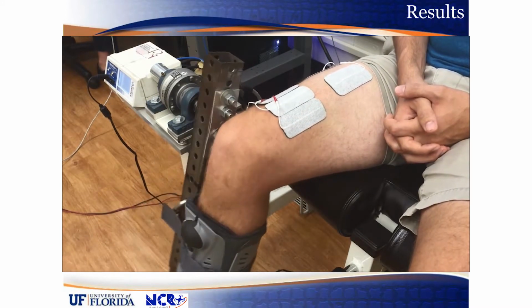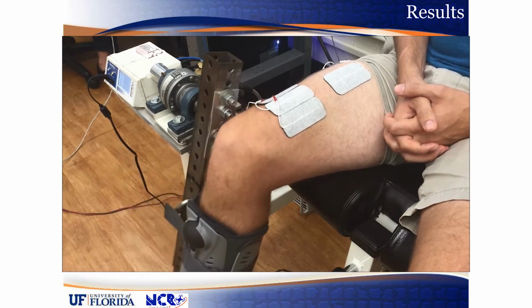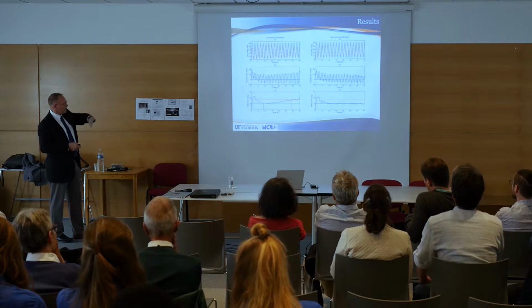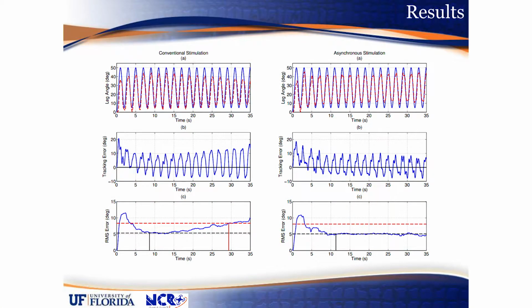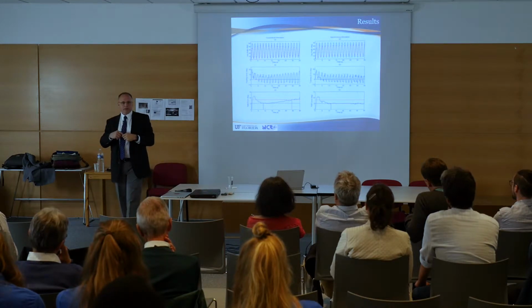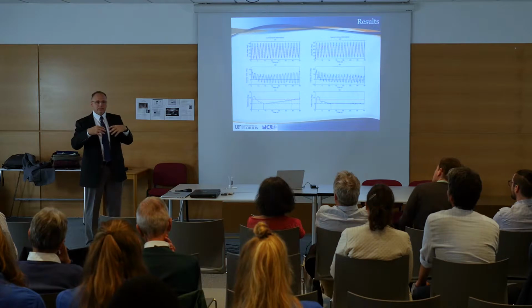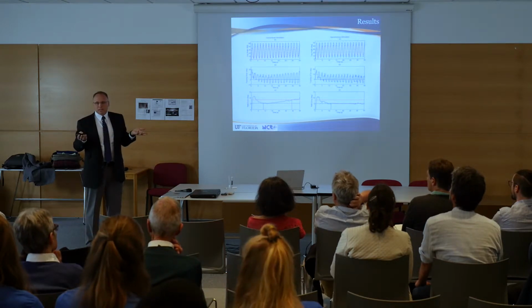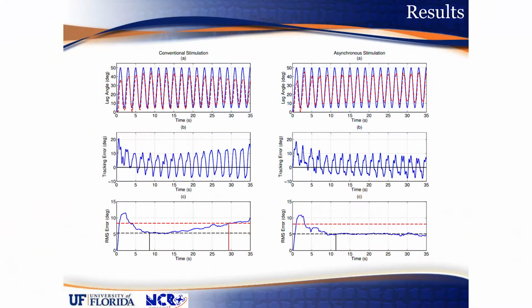You can see the multiple channels across the quadricep there. And even though each channel is at a lower frequency, you still see that overall it's a nice smooth contraction. And the results from that test are that on the left is conventional stimulation, and in this middle plot you see the tracking error is increasing, and that's due to the fatigue, meaning that the controller wants to penalize the error and will stimulate the muscle with greater intensity to minimize the error. But as the muscle fatigues, you can stimulate it as intensely as you want to, but it's not going to produce enough torque. And so even as we're increasing the stimulation to the muscle, it's not able to decrease the error because of the muscle fatigue using the conventional stimulation.